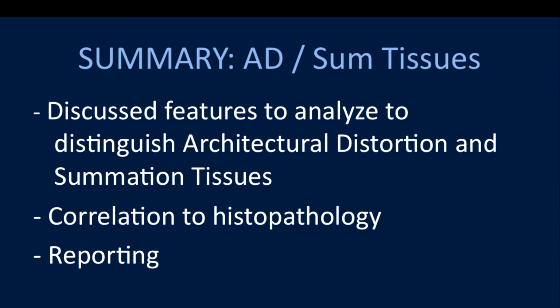No. Again, BI-RADS 3 is not when you're uncertain. The question in the diagnostic workup is, is it real? And in your workup, with the tomo views, the spot views, the roll views, whatever you want to get, you get to the point that you don't think there's distortion there. Now, you could just say, return her to screening. It depends on the level of confidence of the different radiologists. But it's that you think there is no distortion there. To actually say BI-RADS 1 and this is negative, there's no distortion, that certainly is possible.